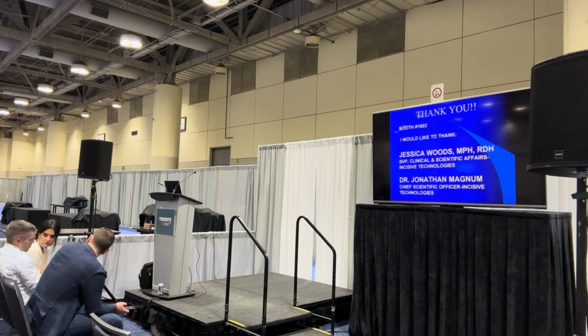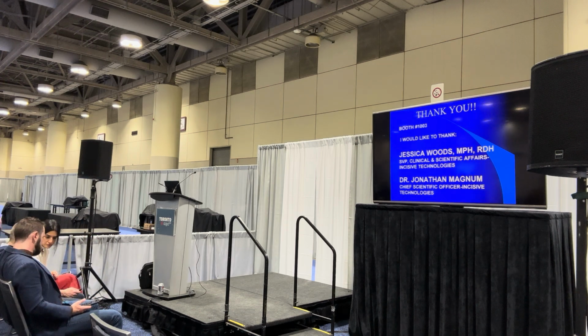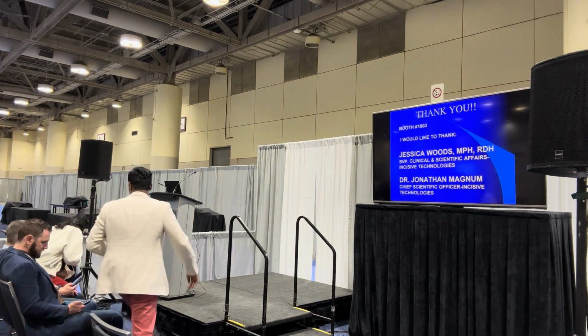I must have come after this part of the presentation, but how long after it's painted does the stain actually appear? Within 2 minutes. But it's pretty blue, so you have them rinse gently, and that washes the excess away, and that's when you can see the blue. And it can stay over time? Well, until you brush it. Or even if you don't brush it, it'll still come off in a few hours just from natural saliva. Okay.